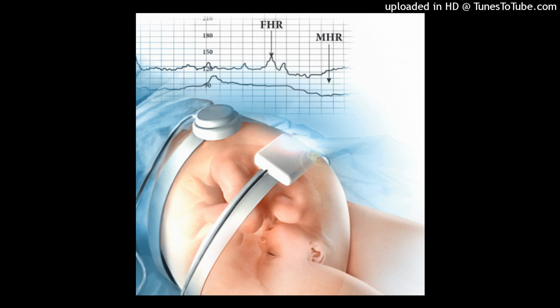The primary goal of intrapartum fetal surveillance is to enable clinicians to assess adequacy of fetal oxygenation during labor. Over several decades, the principal method of intrapartum monitoring of fetal well-being and uterine activity, UA, has transitioned primarily from low-technology auscultation and palpation to high-technology electronic fetal monitoring, EFM. Approximately 89% of births in the United States are monitored electronically, whereas exclusive use of auscultation and palpation in the intrapartum setting is limited.